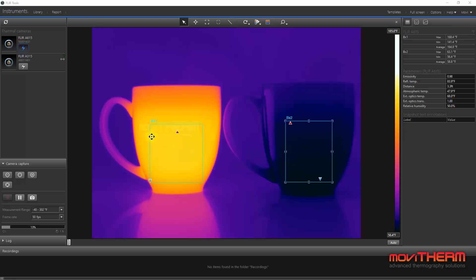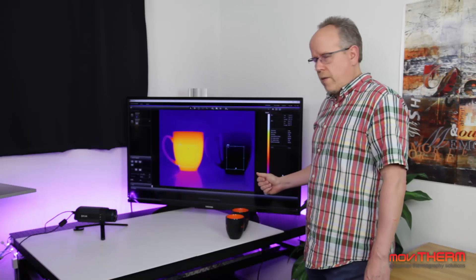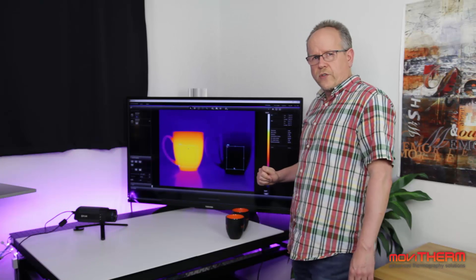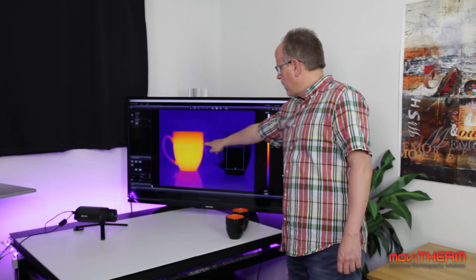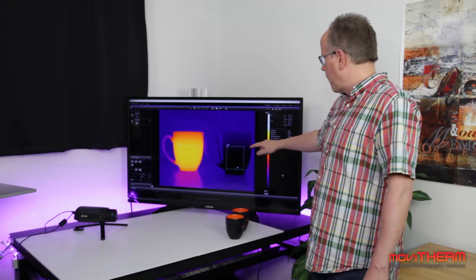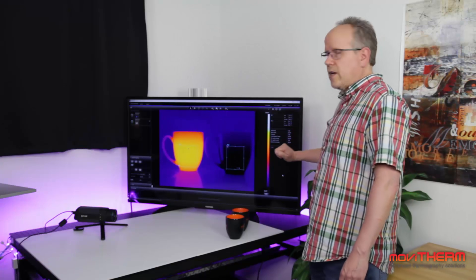On the left side, we have an orange glow which indicates hot temperature. And on the right side, we can barely make out the cold cup. We have drawn a couple of regions of interest around these cups. And we can see here on the software, it actually measures the maximum temperature from the hot cup to be about 170 degrees Fahrenheit, and on the cold side, we see about 63.